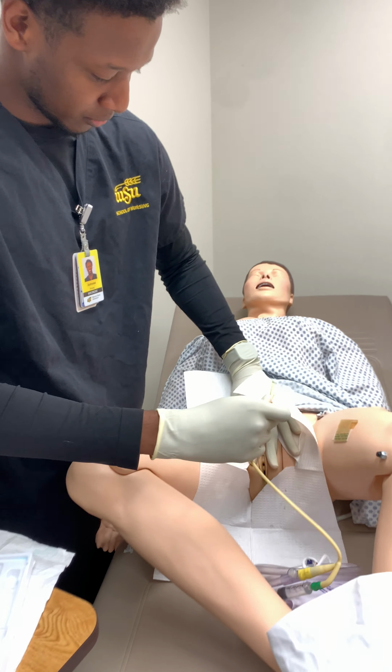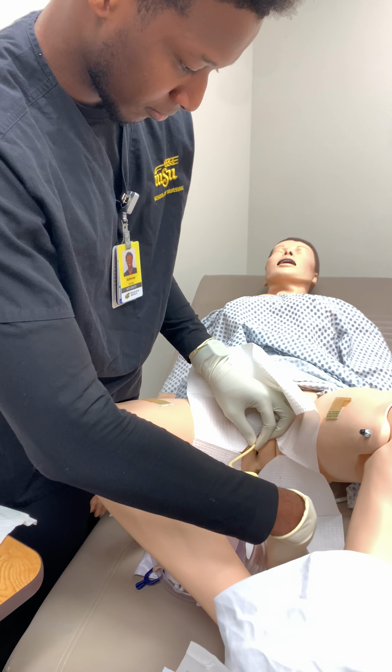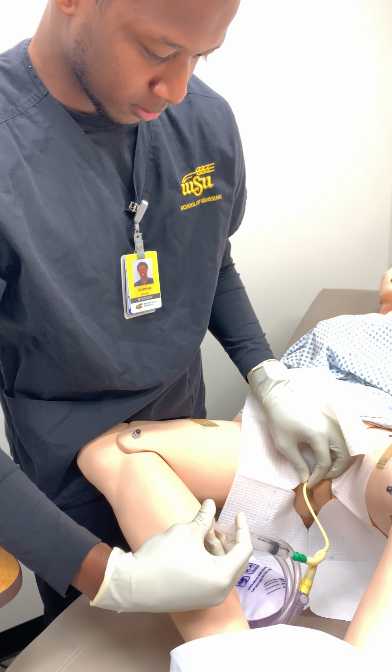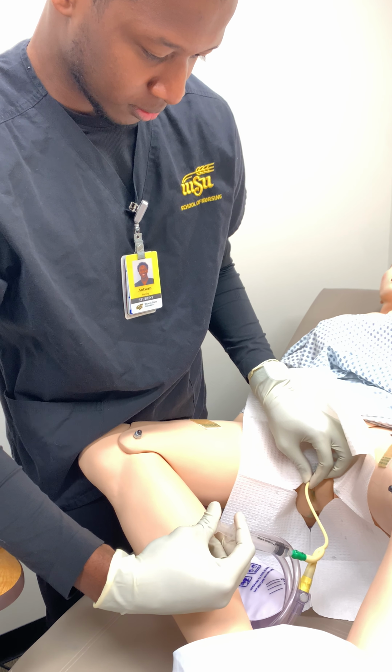After going 2 more inches, I'll use my non-dominant hand to keep the Foley in place, and I'll inflate the balloon. After inflating the balloon, I give it a light tug to make sure it's secure. In this case, it is secure.